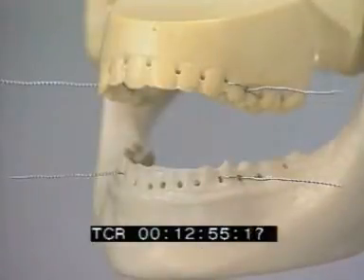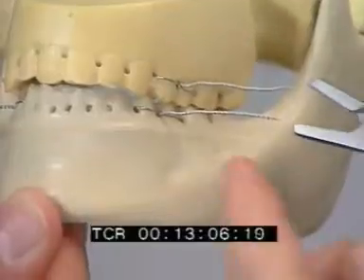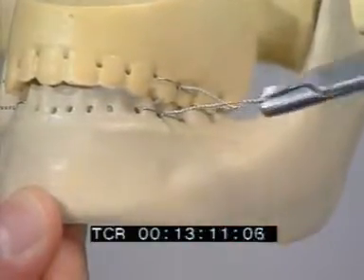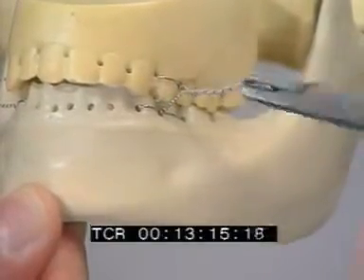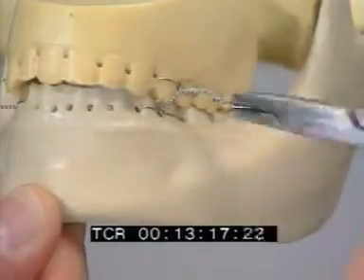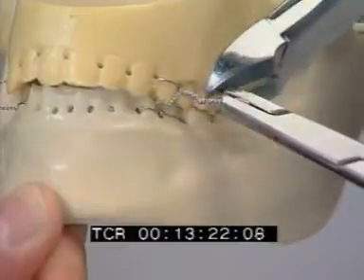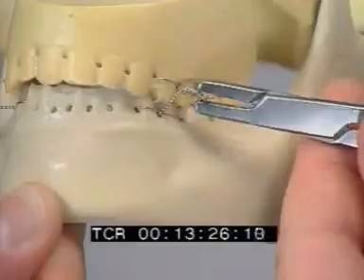Ligatures are now added in the same way in the other 3 sections of the dental arches to form 2 symmetrical pairs. After assuring correct occlusion, the wire ends of each pair of ligatures are twisted together with the wire twisters. Care must be taken at this point not to break the wires. Otherwise, the procedure would have to be started again. The wire ends are then cut and bent towards the dental surface to protect the oral mucosa.